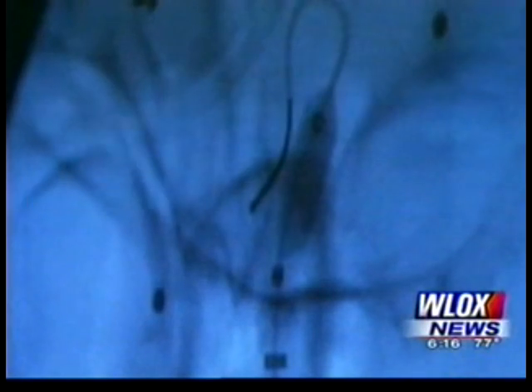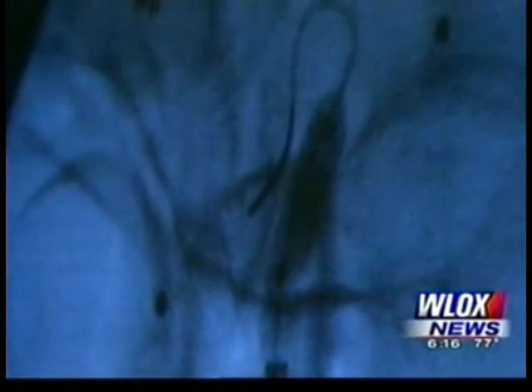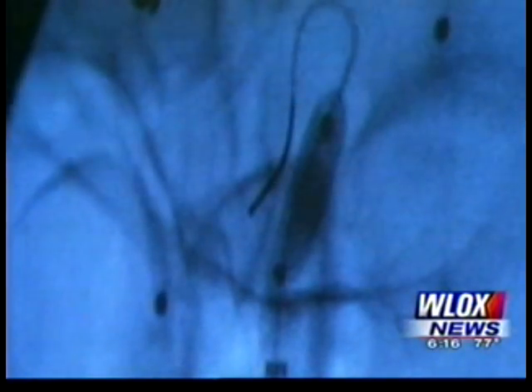What it does is it moves the lining and the little eggshell-thin bone that's right beneath that lining. There's very little to heal. They're actually on the lining of their nose. There isn't anything to heal because we're not making cuts this time like the traditional procedure.